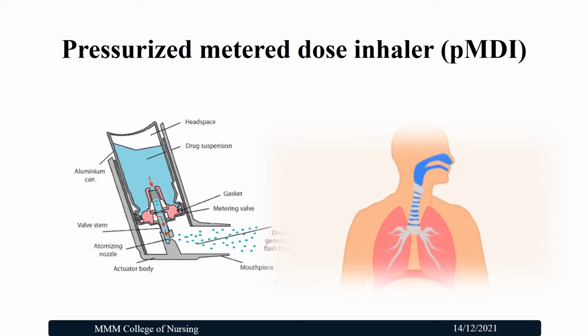As we have seen, during application, when the medicine is forcefully entering into the lungs through the mouth, most of the medicine makes an impact on the oropharynx. So finally, only less than 25% of the medicine is entering into the lungs.